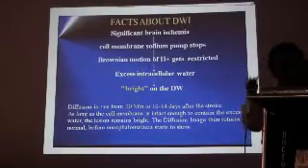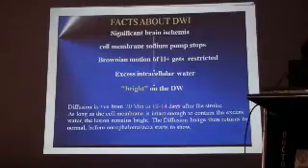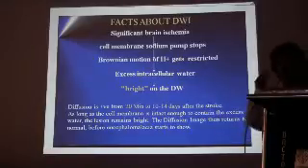That will appear bright here. The diffusion is positive from 20 minutes to 10 to 14 days after the stroke. As long as the cell membrane is intact enough to contain the excess water, the lesion remains bright. The diffusion then returns to normal before encephalomalacia starts to show. These are the important things.